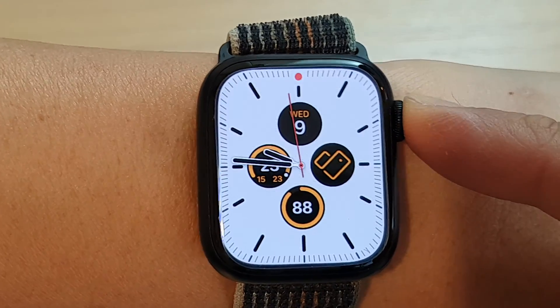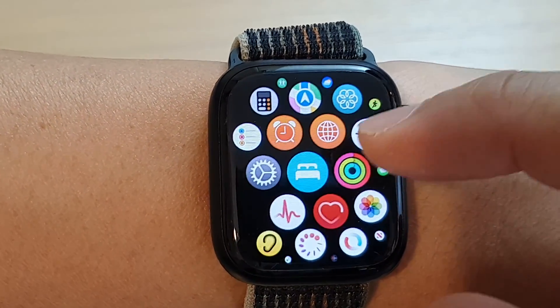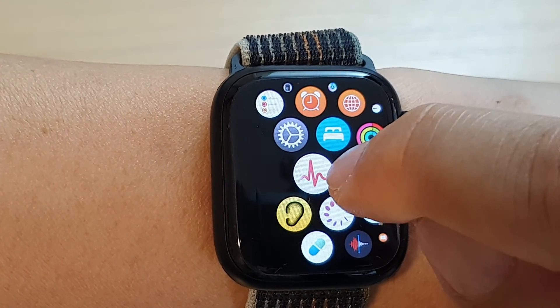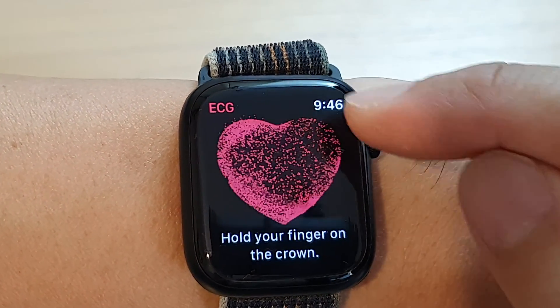From the watch face, press on the crown button. Then in the app screen, swipe across and tap on the ECG icon — it's this one right here. Tap on this icon and this will open up your ECG.